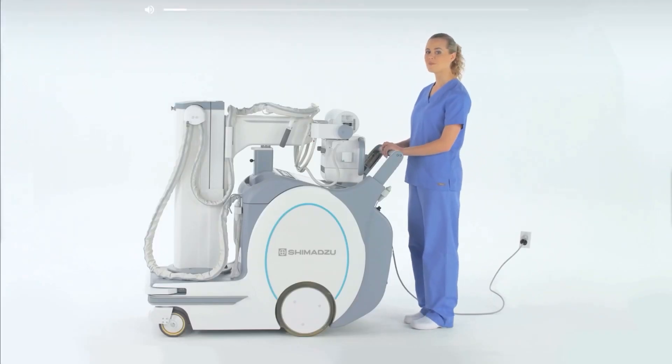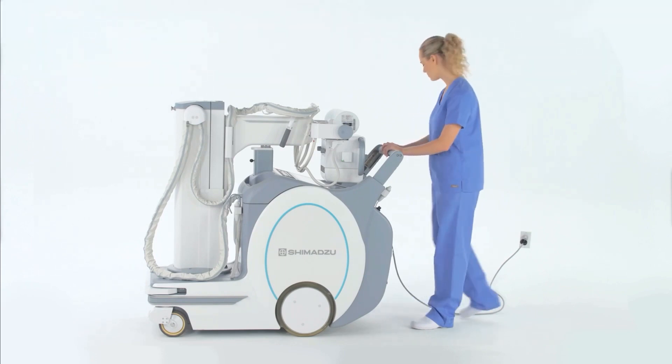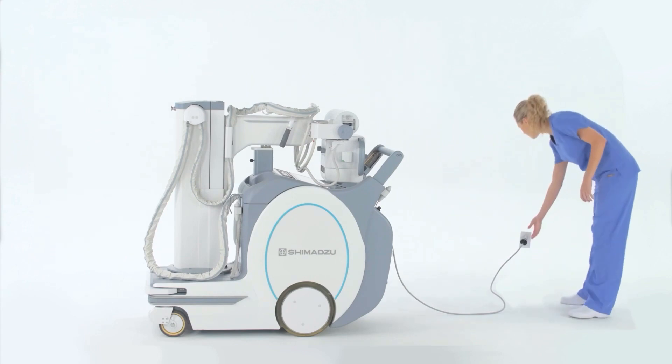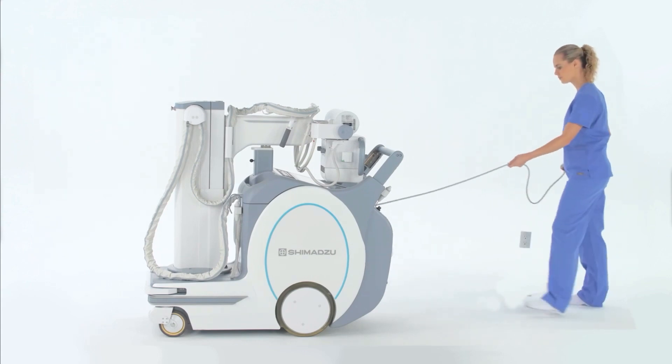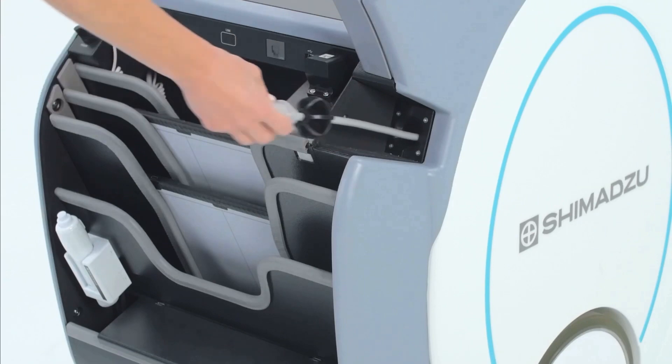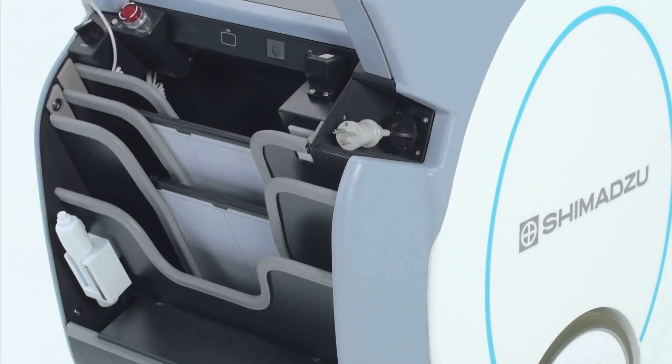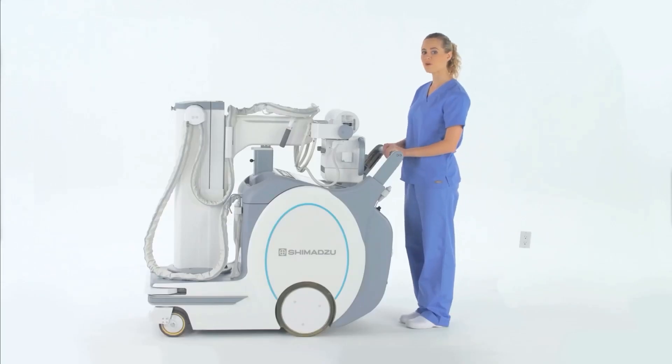When you're ready to use the MX8 mobile system, begin by making sure that the unit is unplugged. You will notice that the cable now retracts into the right rear side of the unit, just below waist height, making it easier to access.